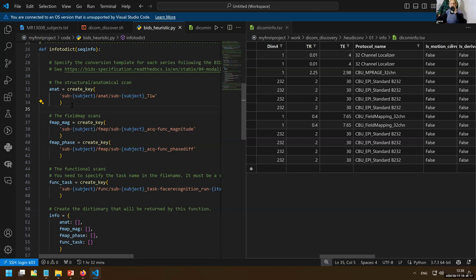If you're not sure, even after looking at the protocol for BIDS, there is a BIDS validator you can run. Basically, there's a little package online you can drag your directory to, and it will check that it meets the BIDS format. We will do it at the end.